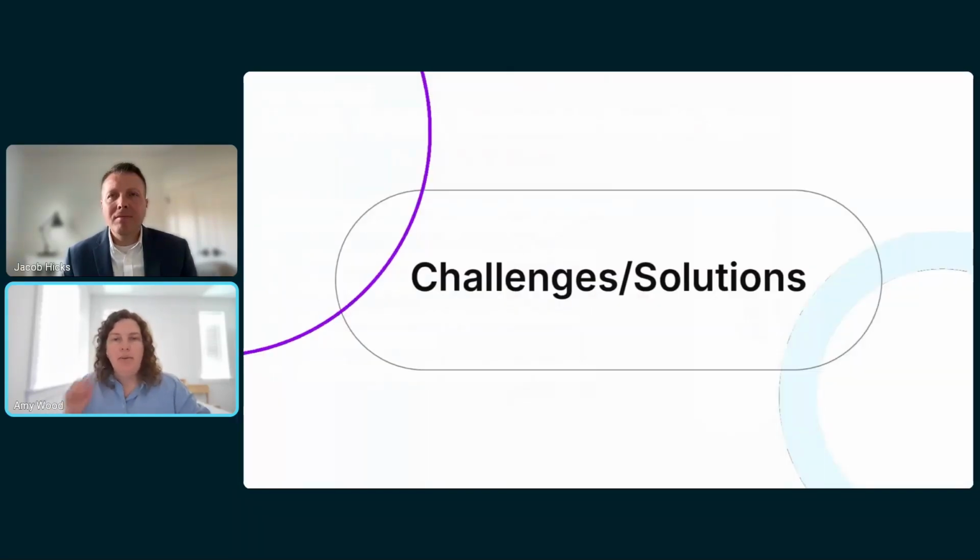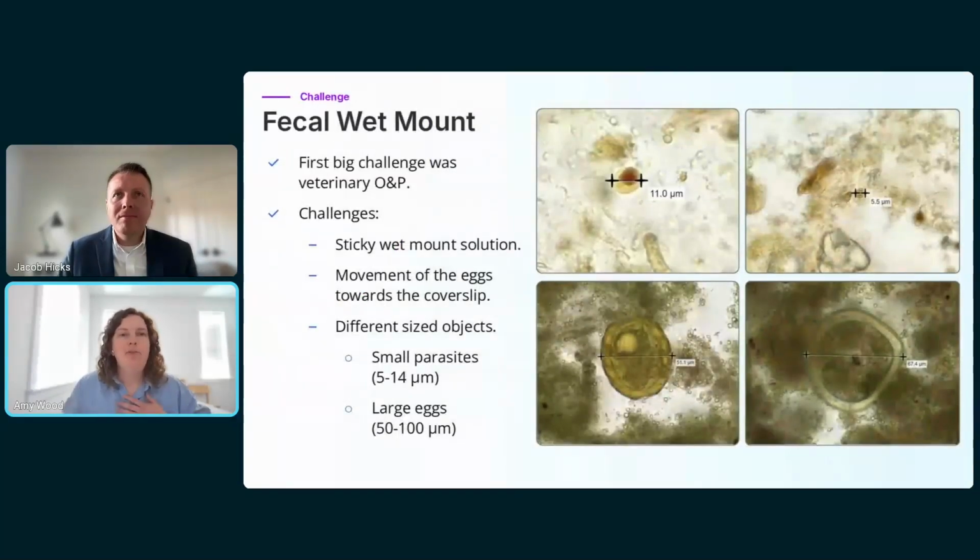So now I'd like to talk about a few of the challenges and solutions that we've come up with at Techcyte to overcome these challenges in the earlier days. Before my time at Techcyte, our first opportunity was to work on veterinary O&P. There were definitely some challenges here. One is that the mounting media is sort of this sticky, sugary substance. And so just being able to find a scanner manufacturer who was willing to let us test these inside their very expensive equipment was a challenge.